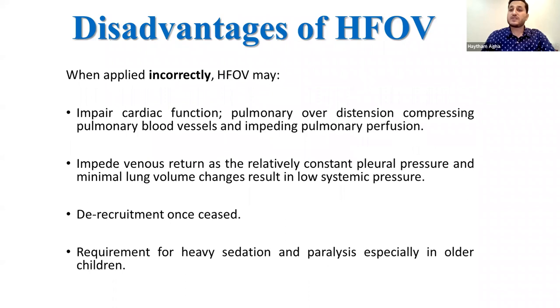Regarding the disadvantages of high frequency ventilation, it's a machine like any other machine. If you use the machine in the wrong way, you will face side effects. So when used in the correct way and avoiding over distension, all of these disadvantages will be avoided. One of the disadvantages is human error. If the machine is disconnected from the patient, all recruitment of the lung will be lost and will go back to the zero state before placing the patient on high frequency ventilation. Also, it requires heavy sedation and paralysis, especially in older children.